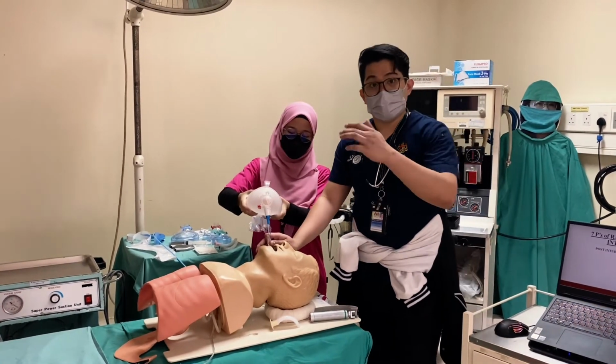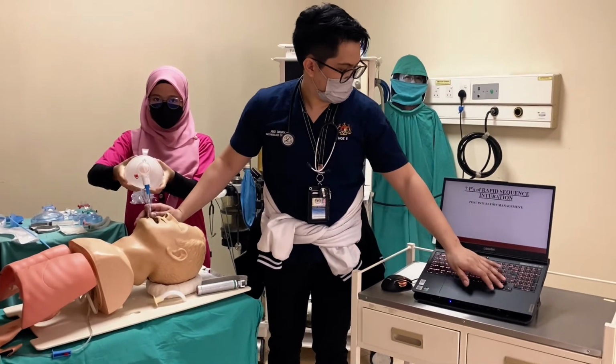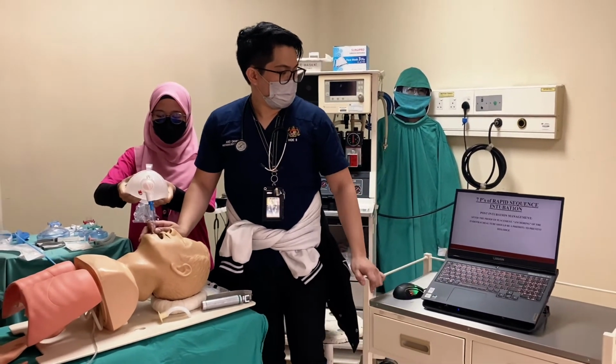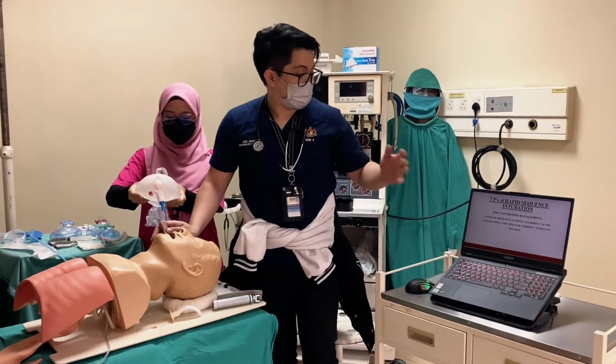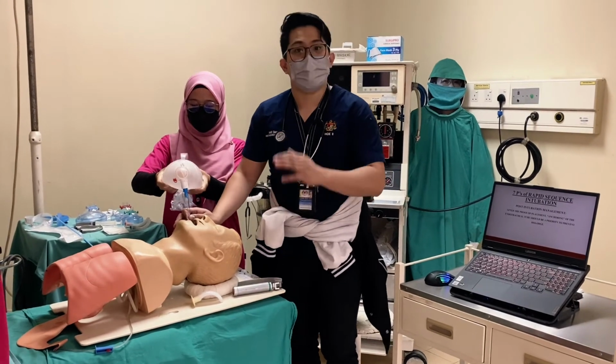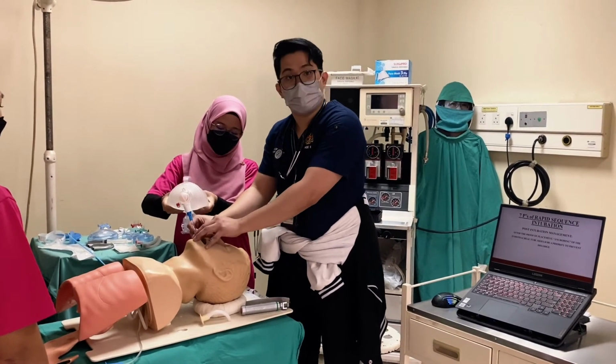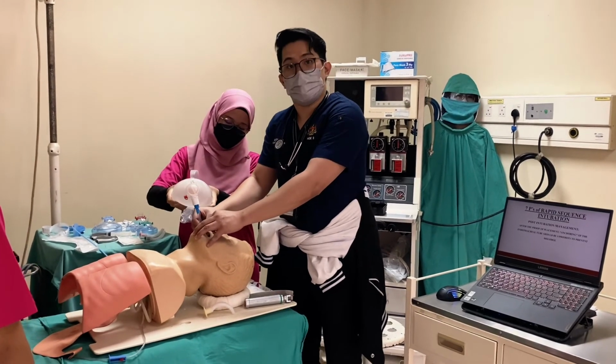Now, the last phase will be the post-intubation management. The post-intubation management is crucial: after the proof of placement, anchoring of the endotracheal tube should be a priority to prevent dislodgement. It means we must make sure the placement is correct, and at the same time, it must be fixed.